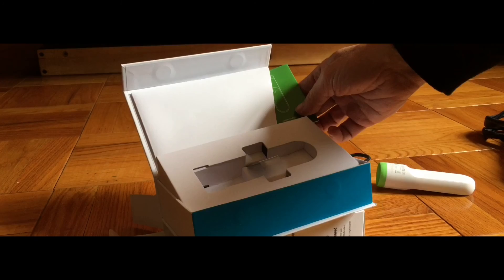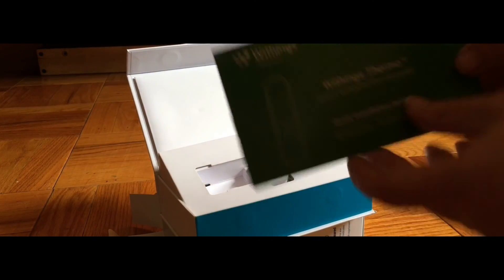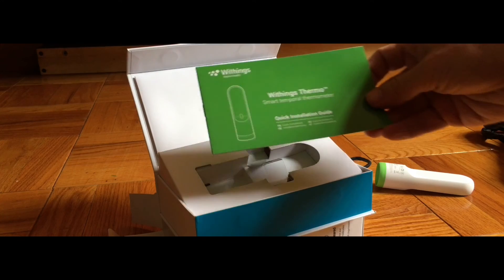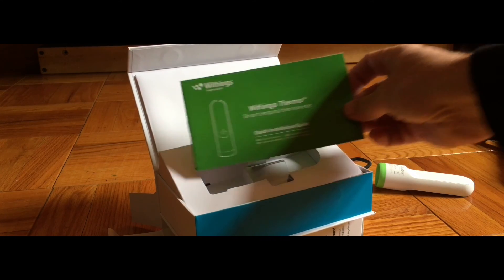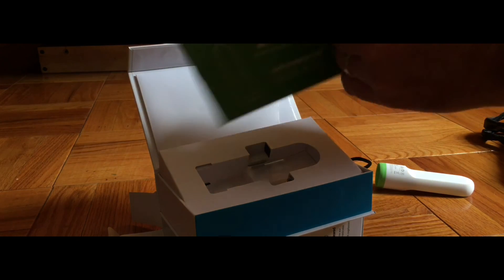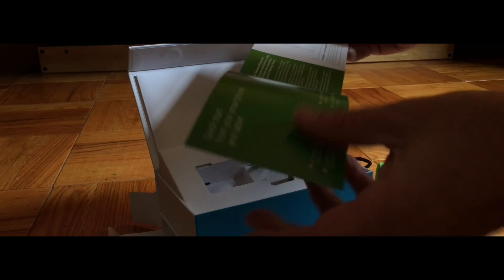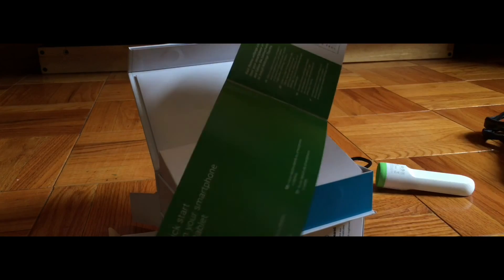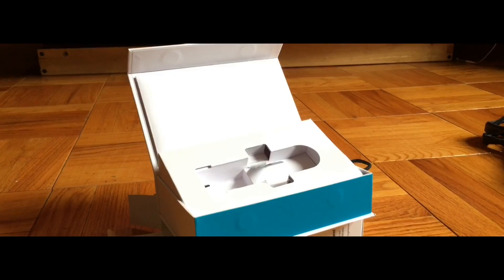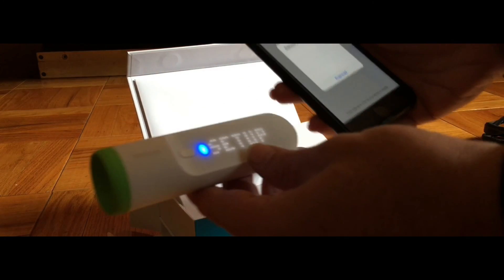$100 is a little expensive, but this is Wi-Fi connected and also Bluetooth to your Apple iPhone or other iOS device. Here's the box, here's the instructions. It's pretty simple to set up — you connect it to your iPhone via Bluetooth, and within a few minutes I was up and scanning.